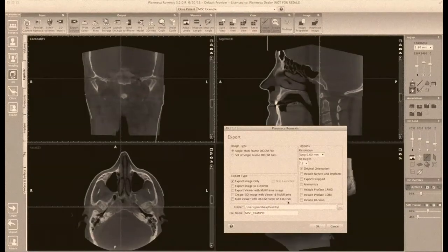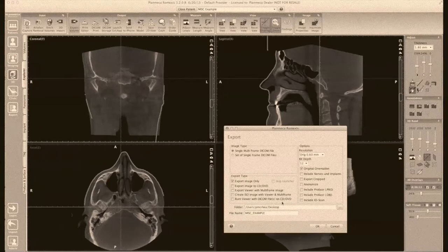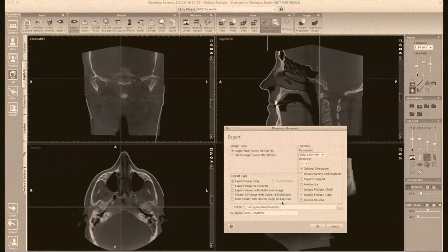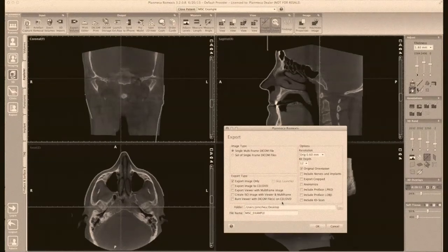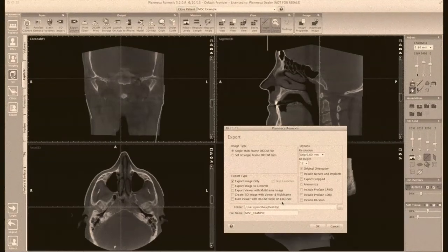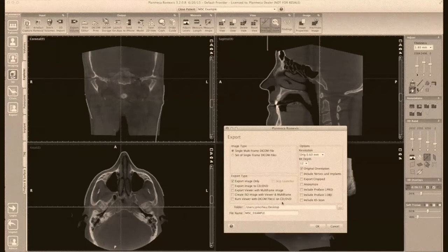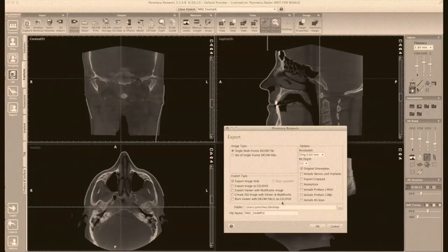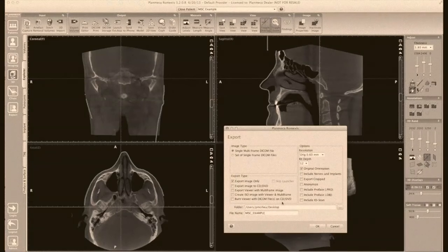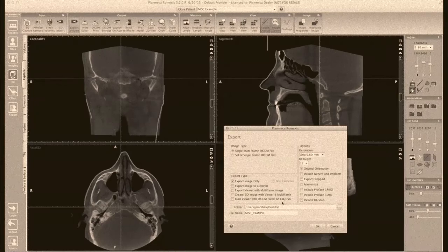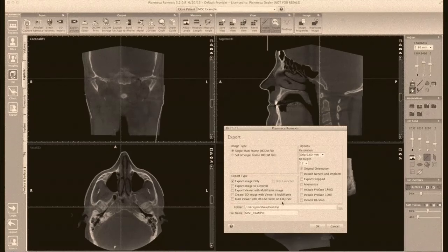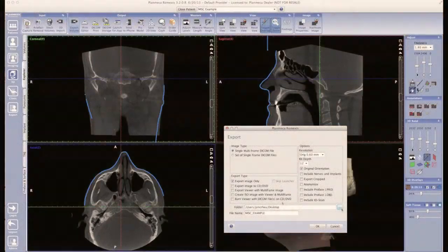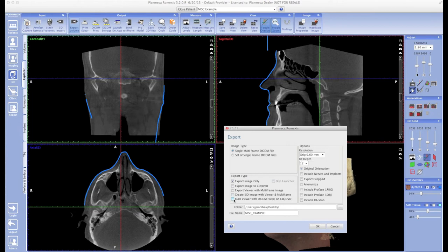So let's get to that. The first thing you're going to want to do is check that box that says Burn Viewer with DICOM Files on CD or DVD. Now, of course, you can use either a CD or a DVD, but I would personally recommend using a DVD. So let's go ahead and put a blank DVD into our computer now.